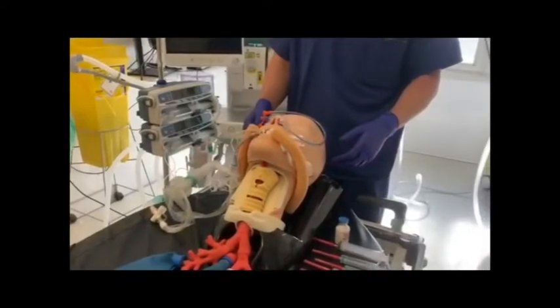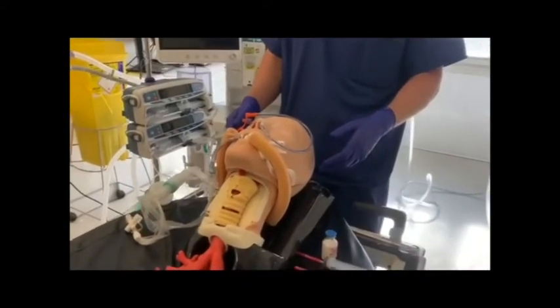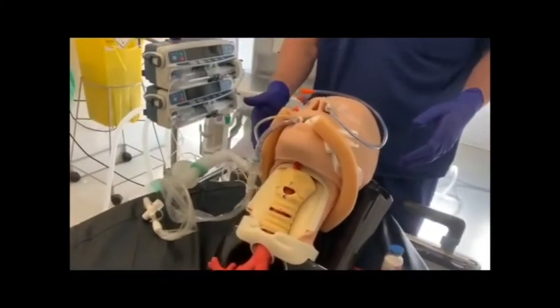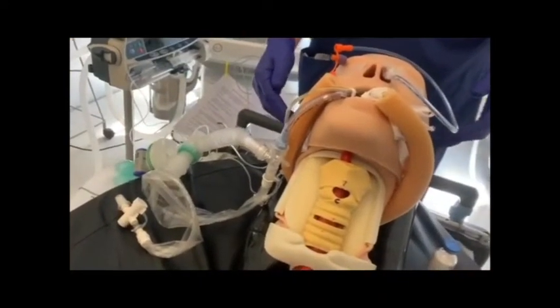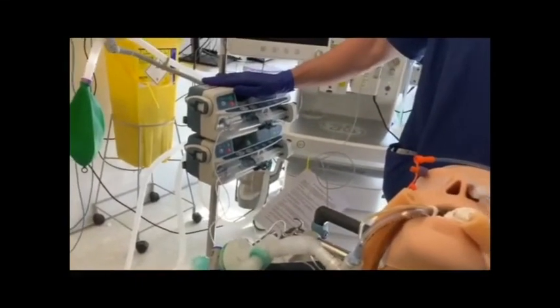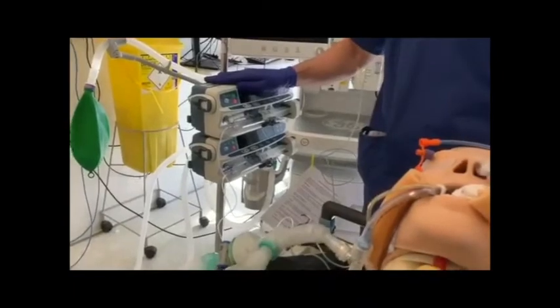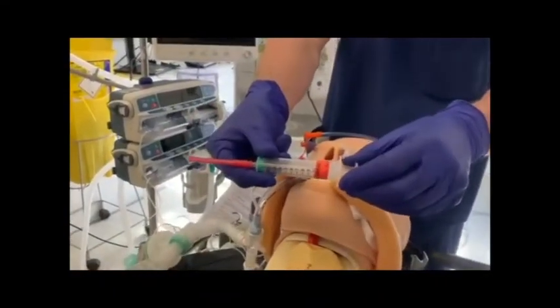Optimally positioned, you need to pre-oxygenate the patient for a minimum of 5 minutes and place them on an SIMV volume control mode. Identify your IV access that you're going to use for bolusing drugs. Please avoid the TPN line if possible. You need to increase your sedative medications to an anesthesia level of propofol and fentanyl, and then you will need to paralyze your patient with rocuronium if you haven't done so already.